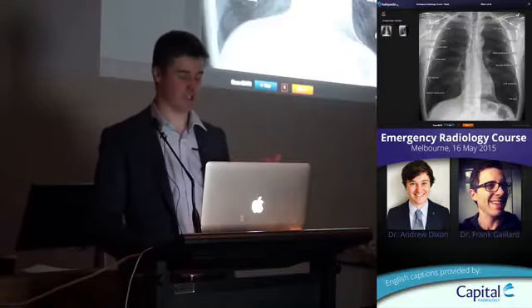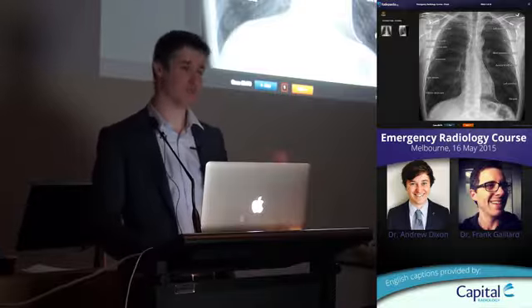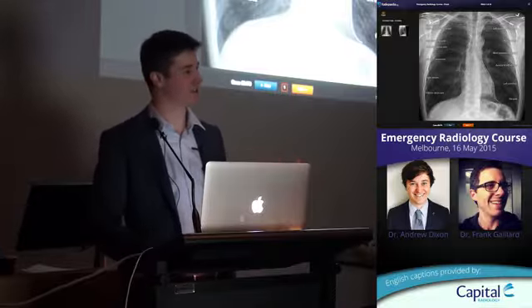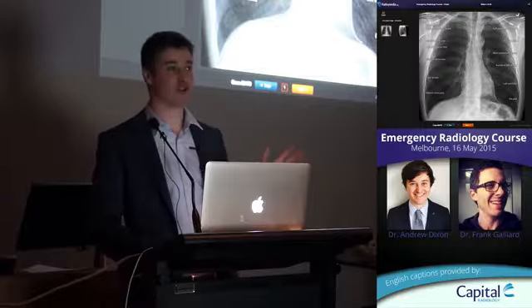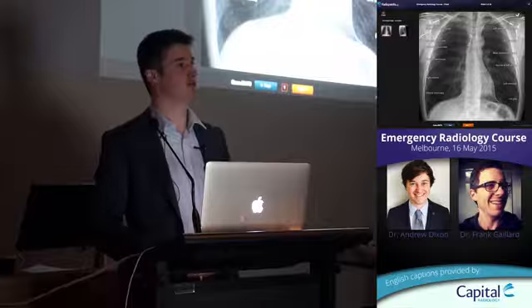All right. So the chest. The non-radiologists often have this idea that if I just knew the checklist of what to look for, I could be a radiologist. And the answer is, it doesn't matter how good your checklist is, if you don't have any idea about the pathology, then you're going to struggle to find it.